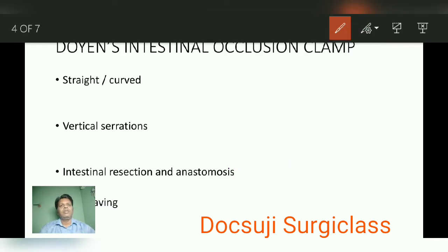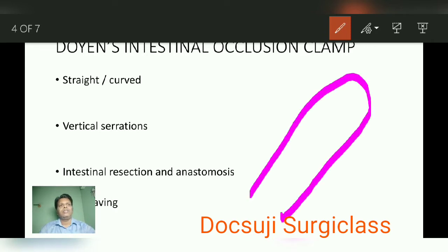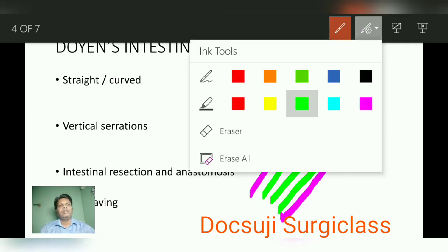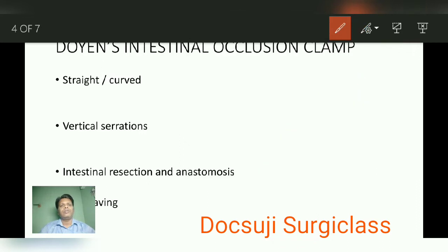Next, if you see inside the blade, there will be vertical serrations present throughout the blade.